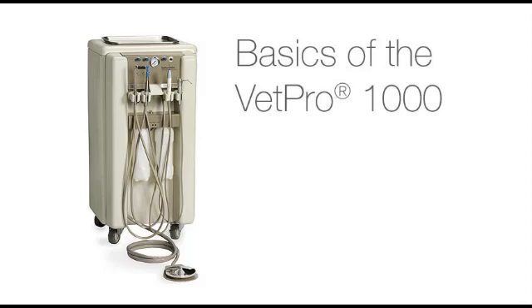Congratulations! You're now the owner of a VetPro 1000. This video covers some of the basics of your VetPro unit. Understanding the names and uses for components of the VetPro 1000 is important for your success.